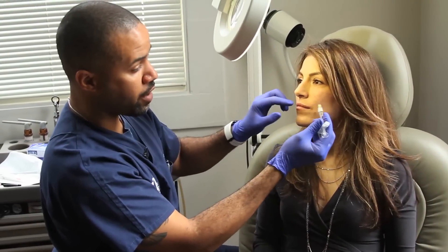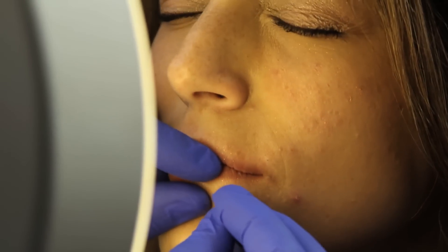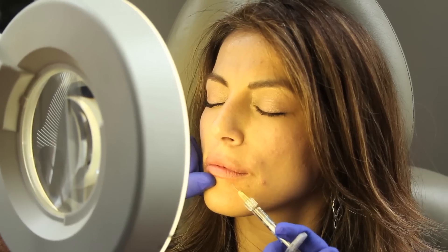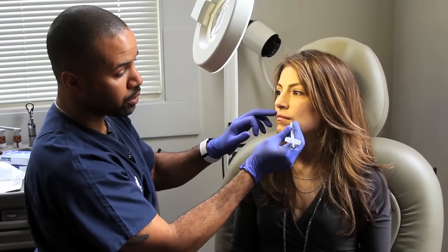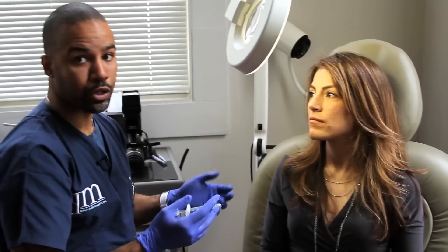A question that some patients ask is: with these needle pokes, are those holes any larger and do they stay open long? The answer is no. Especially when we're injecting Restylane, I still use a very small needle, and these little pokes will be closed in an hour or so.